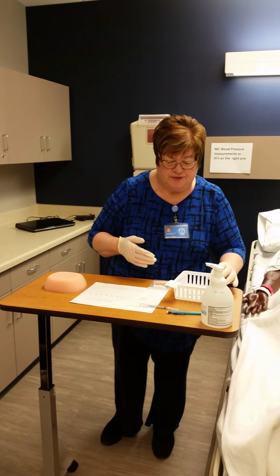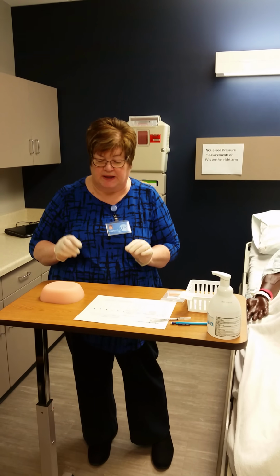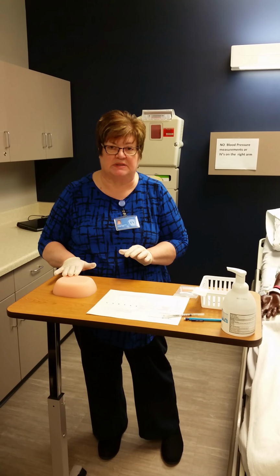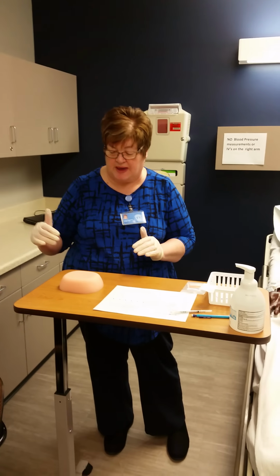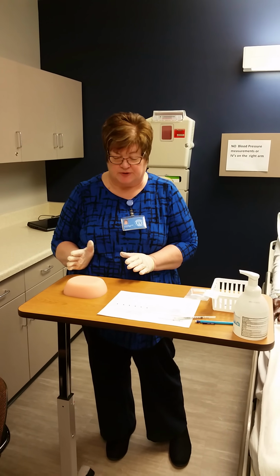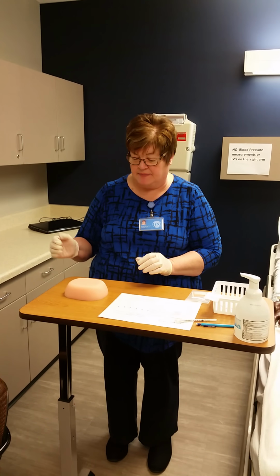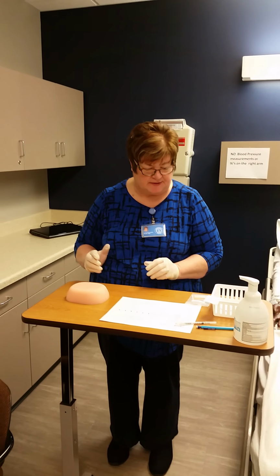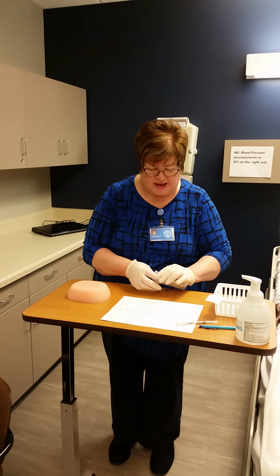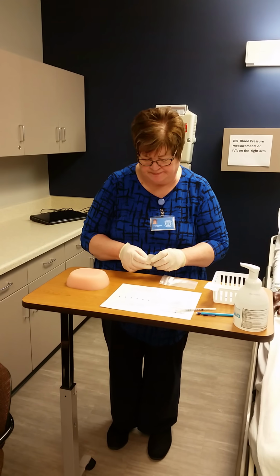Okay, in class you created your bleb on the hot dog, so this will not happen with this equipment that we're using today. What we're looking at today is that you have it going in at the right angle, 5 to 15 degrees, that you haven't crossed over your site after you've cleansed it or over the needle once it's inserted, and that you injected the medication in safely. All right. So you'll have a dry alcohol pledget that we'll be using.